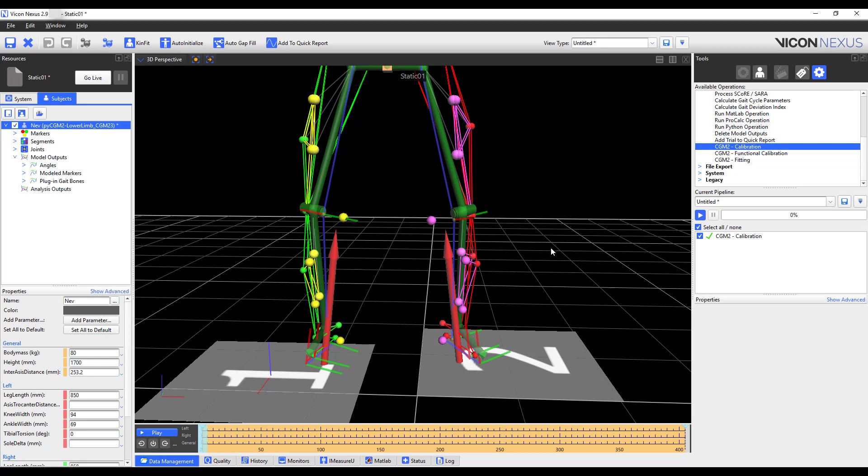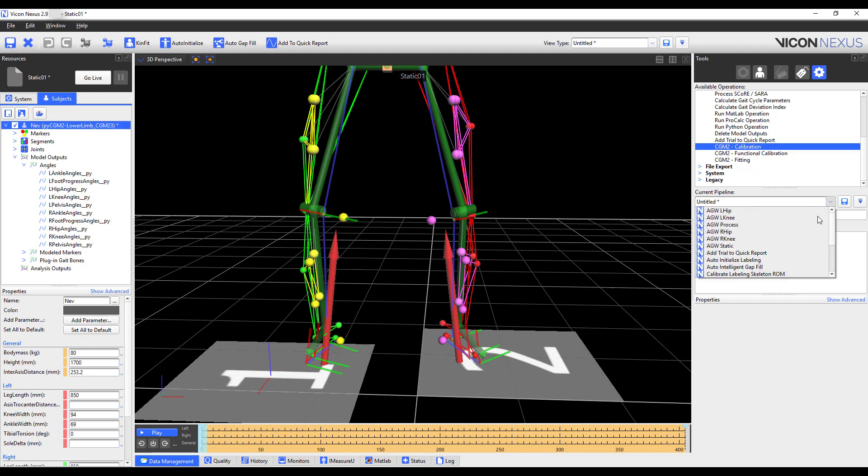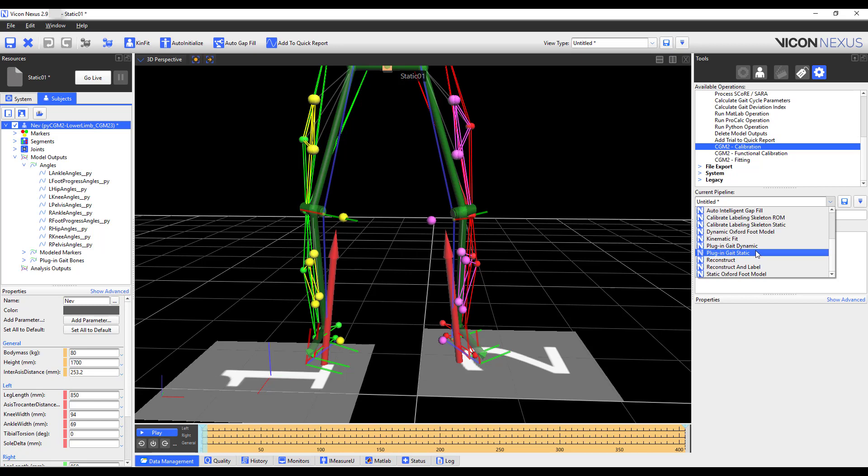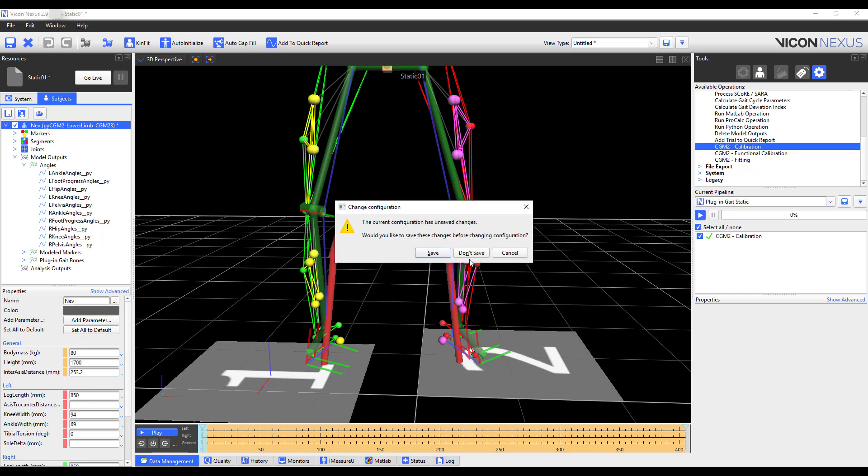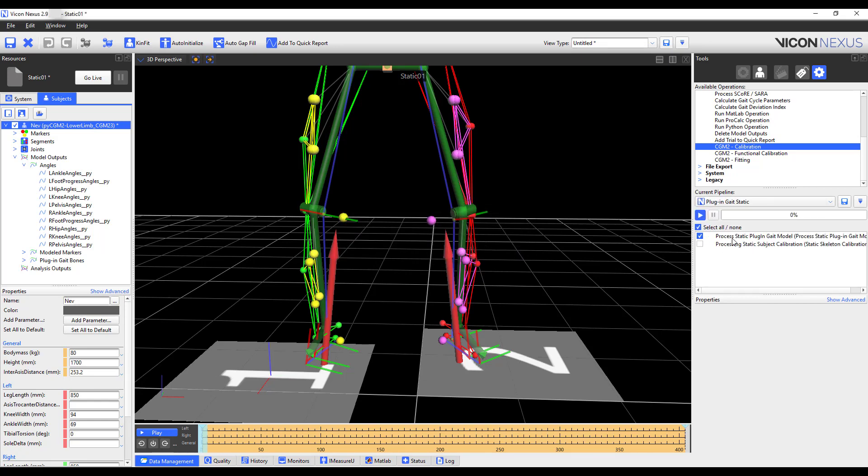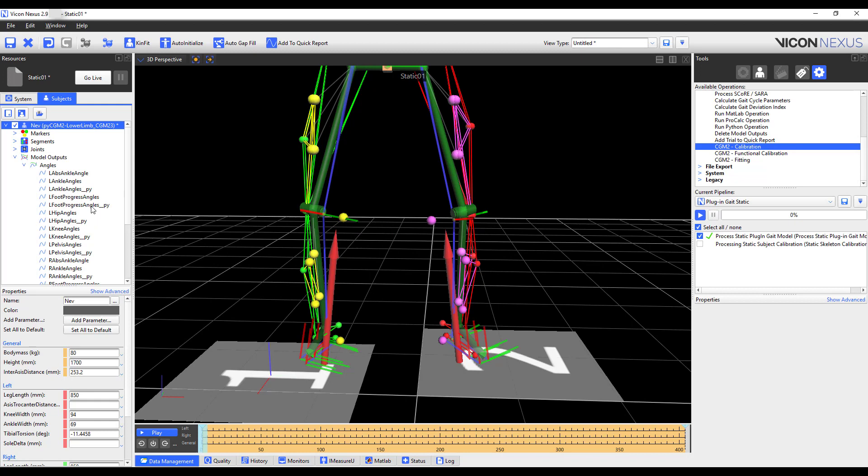When complete, you can see that I have calculated model outputs, and that all the model outputs appear with the underscore py. If I want to go ahead and run the plug-in gait static now, just for comparison purposes, I can do so, and you can see that I'll have model outputs for both. I'm going to go ahead and save the trial, and then process the dynamic trial.